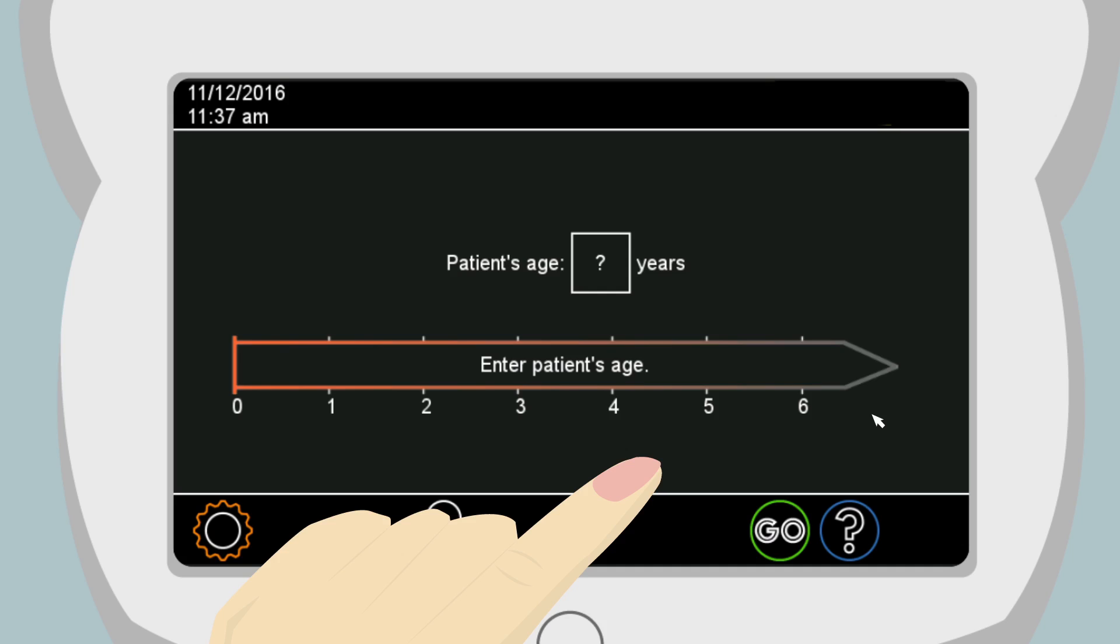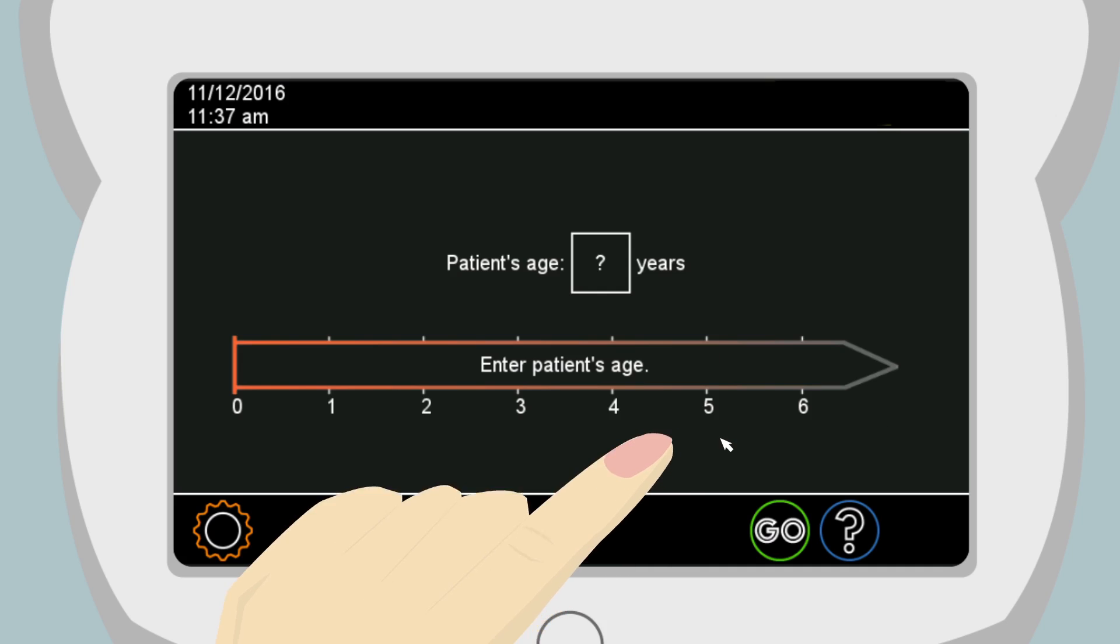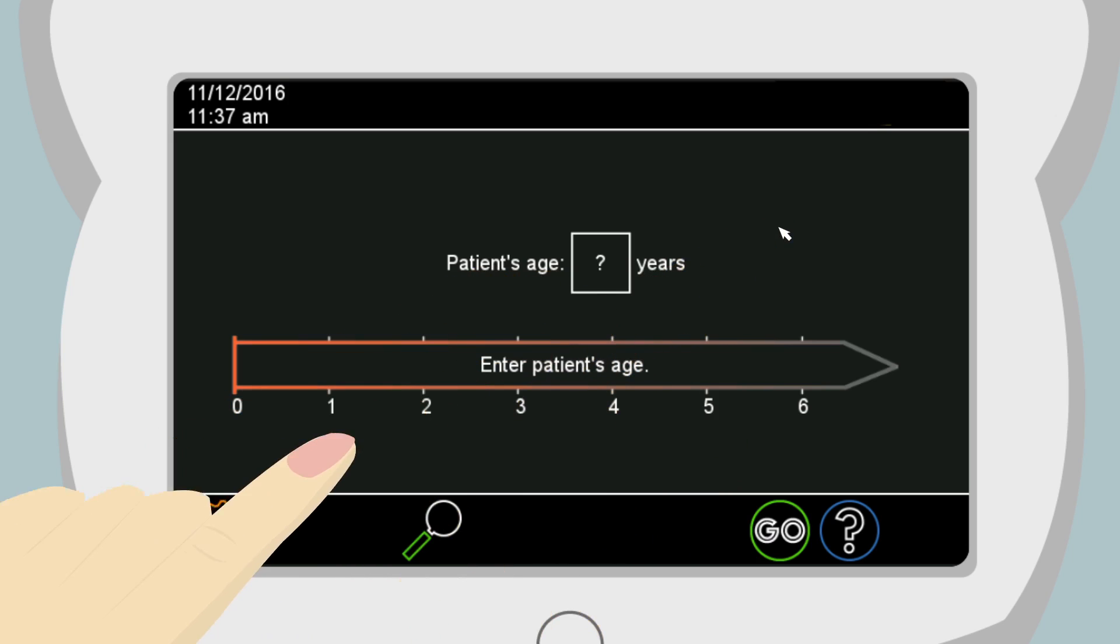If the device does not respond to the touch, the touch may have missed the button. The cursor arrow will show where the device sensed the touch.